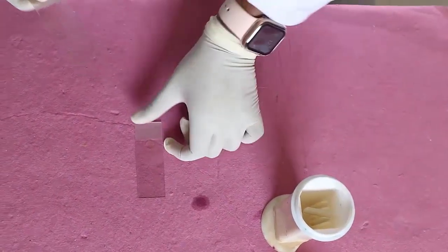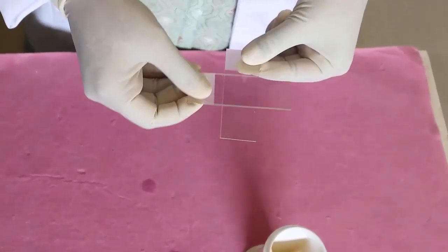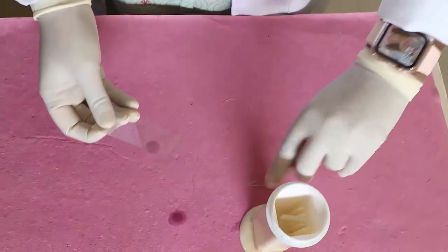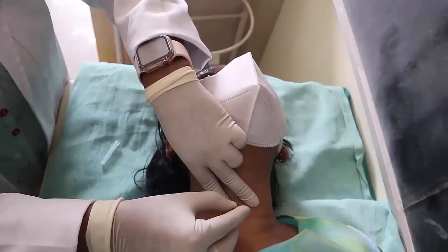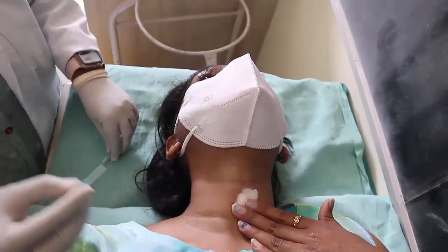For a dry smear, the above step is repeated, but the slide is not placed in ethanol but kept outside for air drying. After the procedure, firm pressure with cotton should be applied to prevent hematoma formation. It is not always that the slides prepared are satisfactory.